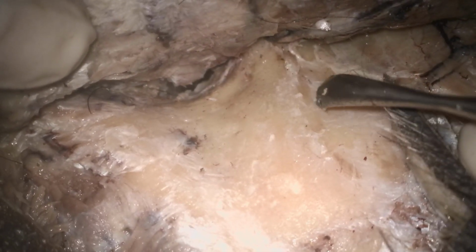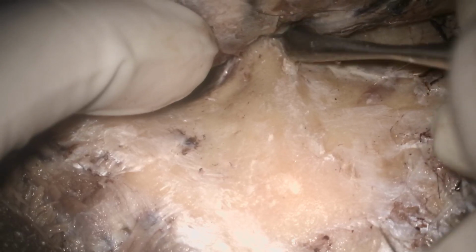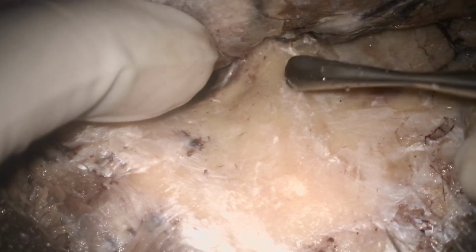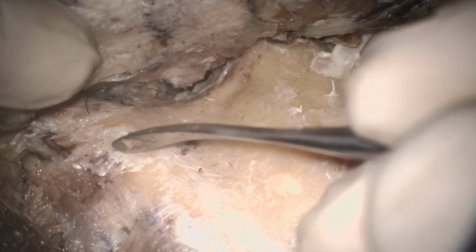Then what are the other landmarks? Look, this is the landmark for the tegmen plate. This is the linea temporalis, the attachment of the temporalis muscle, the lower border. This is the attachment of the temporalis muscle, that we call the linea temporalis, that actually corresponds to the level of the tegmen tympani and the tegmen antri, the middle cranial fossa. Okay, and inferiorly this is a tangent line.